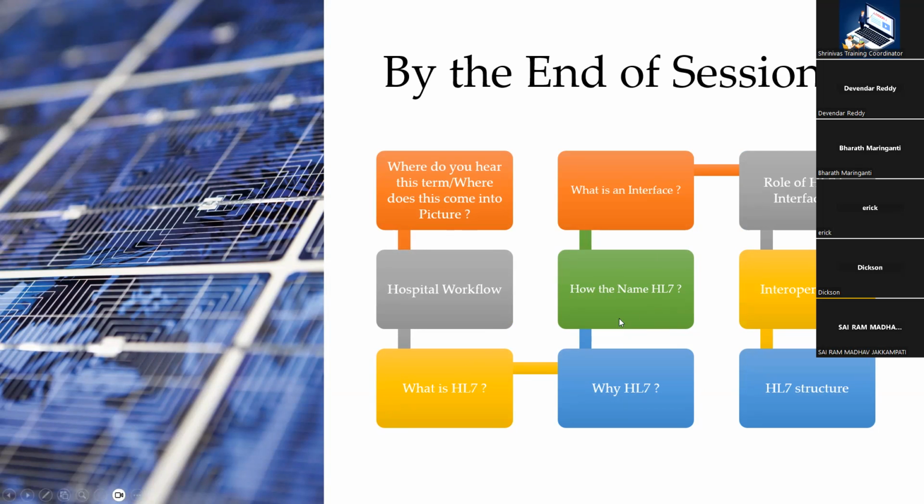Then we will talk about why we need HL7 and how the name HL7 came into play. And then we will talk about the role of HL7 interfaces in today's world. Then we will talk about what interoperability is. And then we will talk about the basic HL7 message structure. So that's what we'll take a look at.